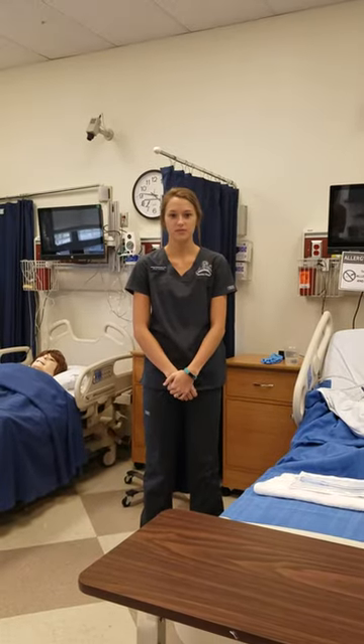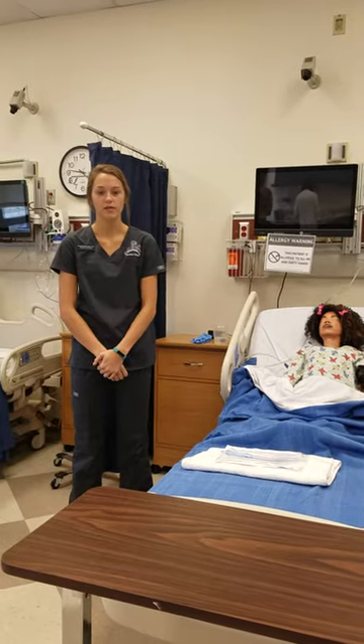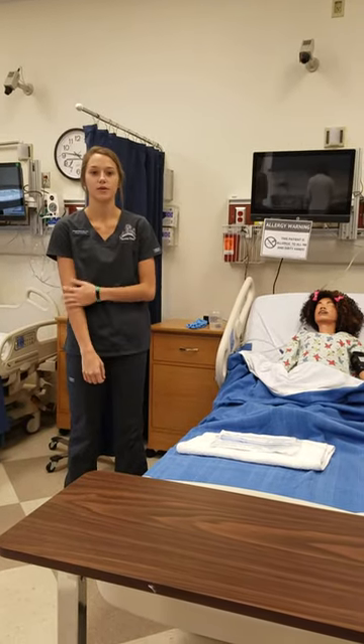Hi, my name is Abby McNally. I'm a first semester nursing student. Today is November 17th at around 9:20 in the morning, and I'm going to be doing oral suctioning.